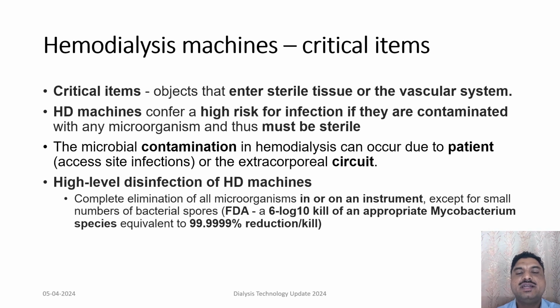Microbial contamination in hemodialysis can occur due to the patient, in the form of dialysis access site infection, or from the dialysis machines as an extracorporeal circuit. So for these HD machines, a high level of disinfection has to be achieved.